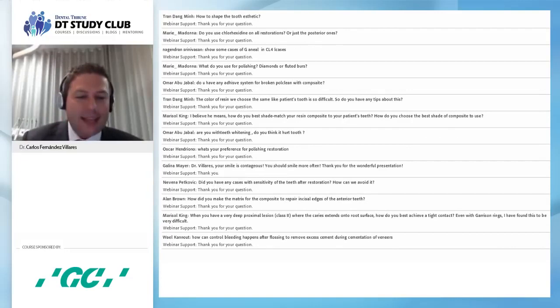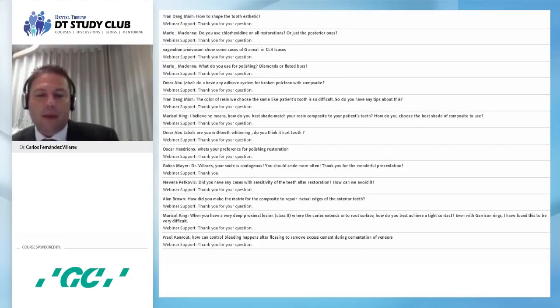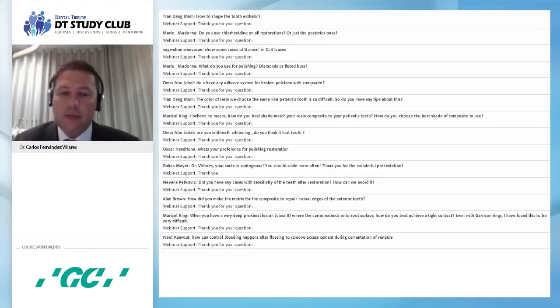My patients are exactly the same as all of yours, and they have problems with bleeding and gingivitis. We try to do our best in our practice, but sometimes we have that problem. So we try to treat every patient who is going to have problems with bleeding. Use rubber dam, thick rubber dam, and then you will have no problem. If not, you can use retraction cords with some retraction paste, and you will have very good success.